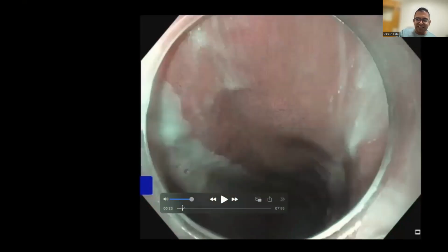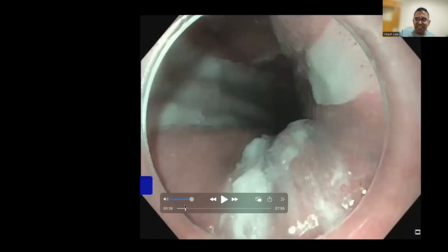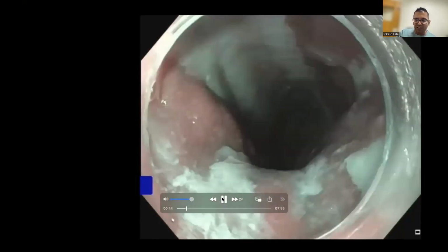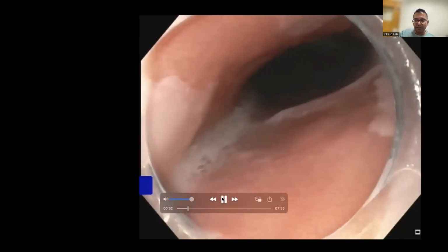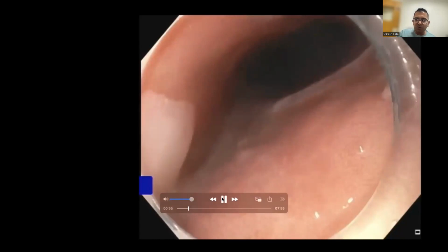So I did assess the inlet patch in white light as well as in virtual chromoendoscopy with NBI. But you can see a very, very large inlet patch, which you'll see the end of it now. That's the end of it. And then you see the start of his Barrett's segment. So this patient had an ultra long Barrett's, more than 10 centimeters. His C and his M were almost the same.